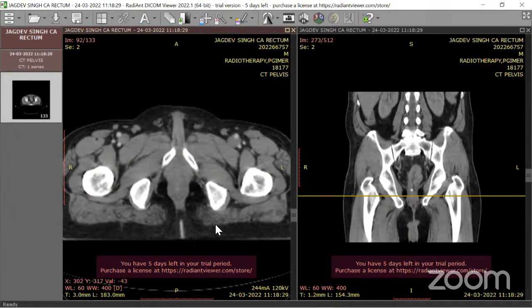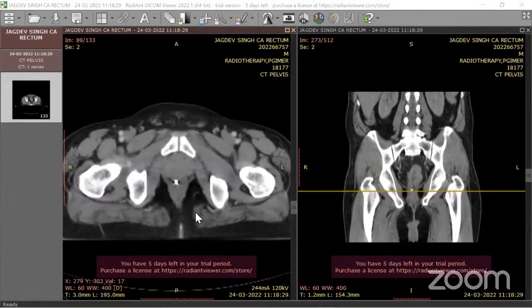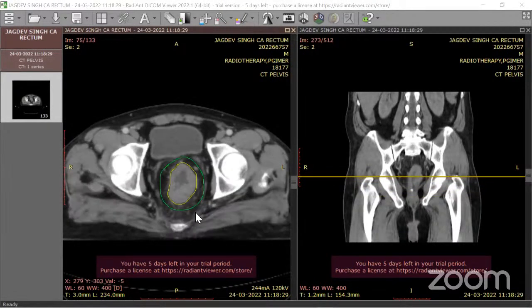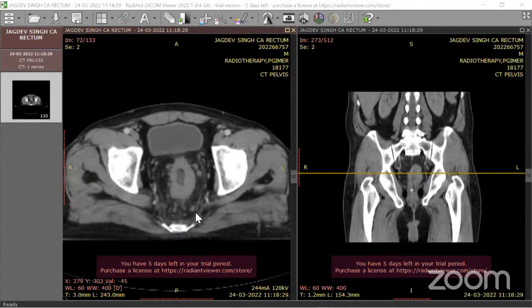The best part was that in many classes, they don't tell us that you need to include the sacral notch nerve roots. So that part is very, very important. These are small little intricate details that we have always looked into during our residency. So this is very, very important. If you feel like you need to include or not, there are various schools of thought, but it's better you include the sacral notch nerve roots.